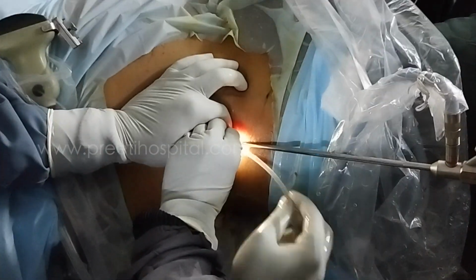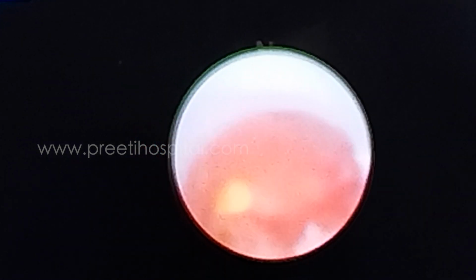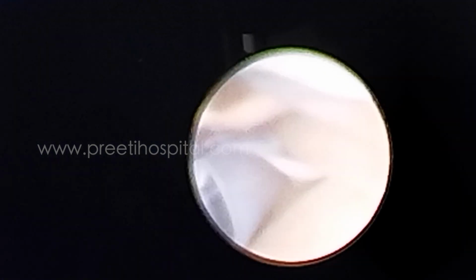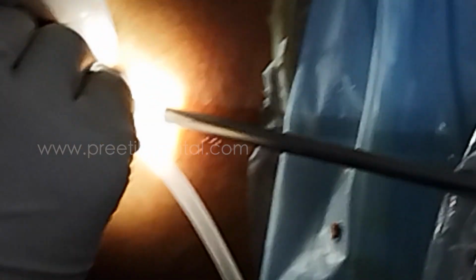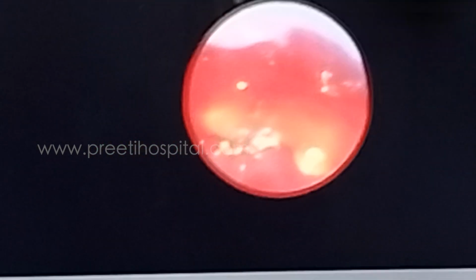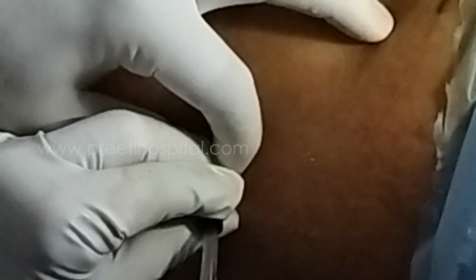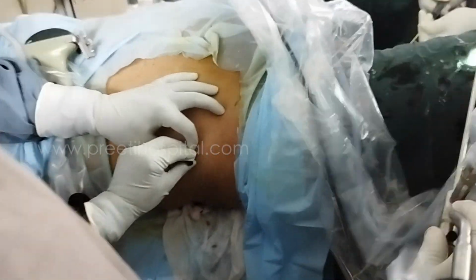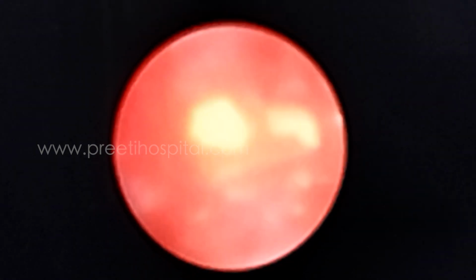Okay? Suction. He is pushing. This is the disadvantage of going from the lower calyx to the upper calyx. It's easy, but who is the obstructing factor? Can you see? Completely cleared. Now can you see the pelvis? Now some more clot, everything is there. Suck it out. Now it is easy. So if this thigh is adducted, you can make all movements. So if you are doing only PCNL, let the thigh be adducted. That is the point.